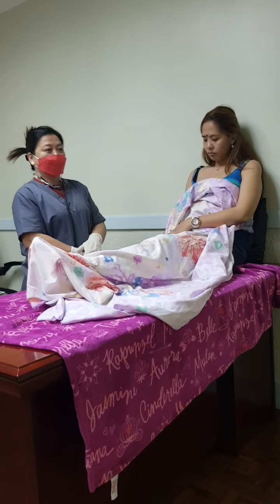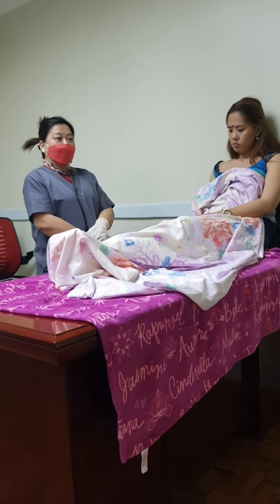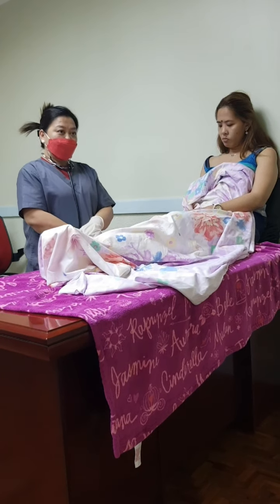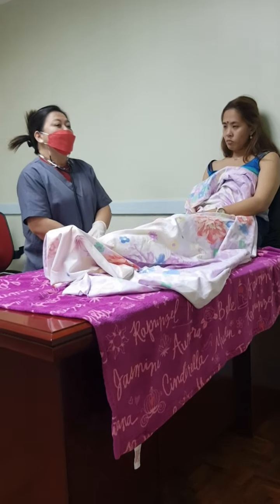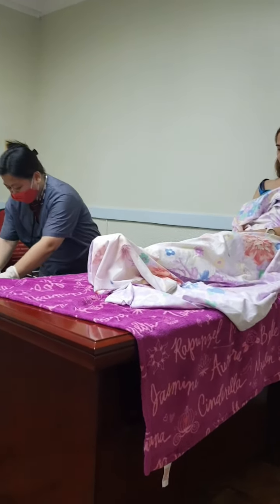Check the nostrils for patency by asking the client to occlude one nostril and breathe normally through the other. Clean the nares using cotton balls.